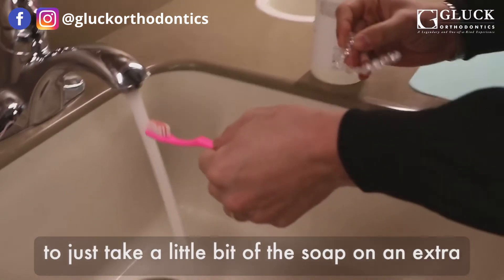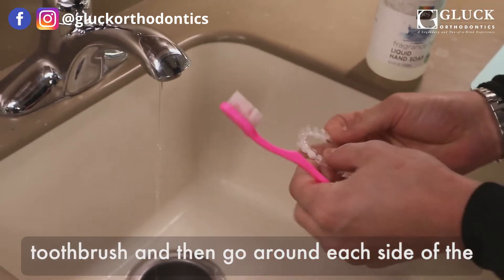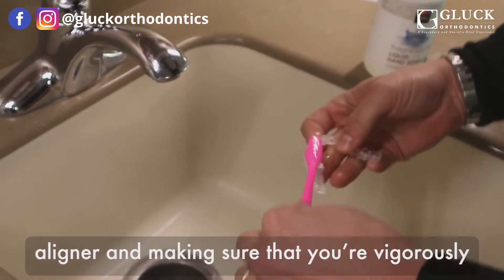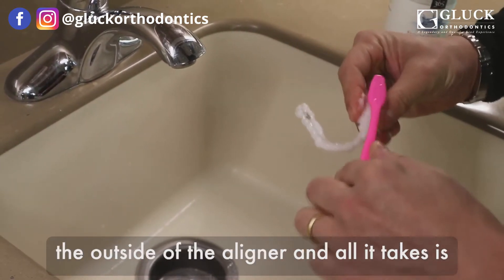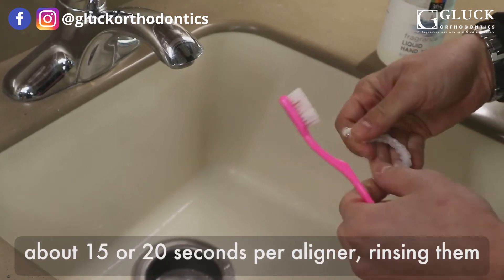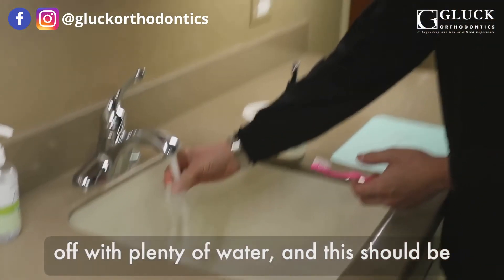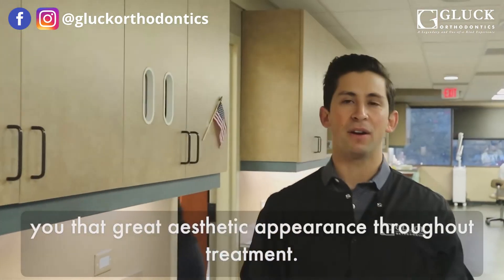You want to just take a little bit of the soap on an extra toothbrush and then go around each side of the aligner, making sure that you're vigorously scrubbing the inside of the aligner and then the outside of the aligner. All it takes is about 15 or 20 seconds per aligner, rinsing them off with water. And this should be enough to keep the aligner nice and clean and give you that great aesthetic appearance throughout treatment.